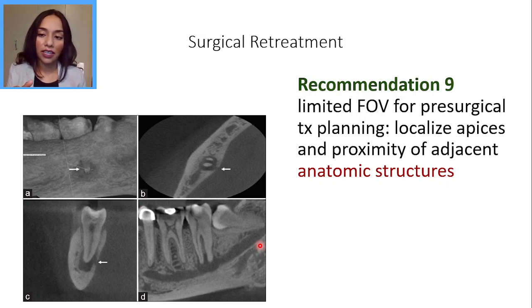And so, like I said, being able to take a CBCT ahead of time in this specific sense, pre-surgery, can help manage risks and understand how the whole body relates to one another. Sometimes we focus in on one specific tooth, but we need to understand that there are a lot of other considerations that we need to take, and hopefully translate that to our patient and say, hey, this is what's going on in your mouth.